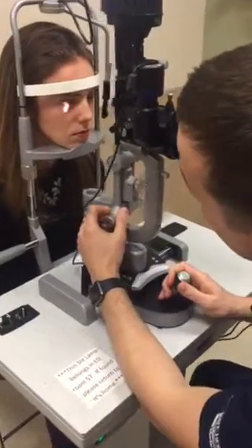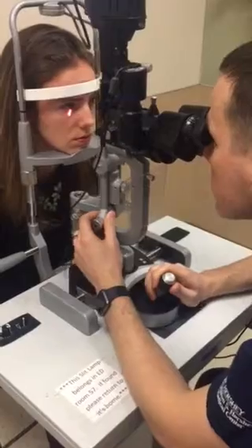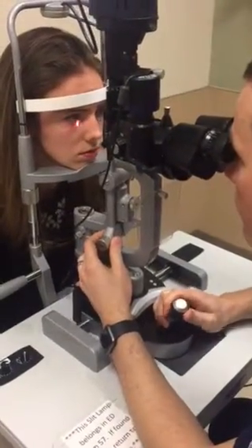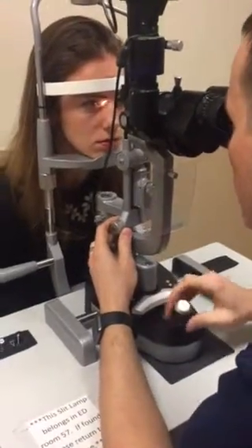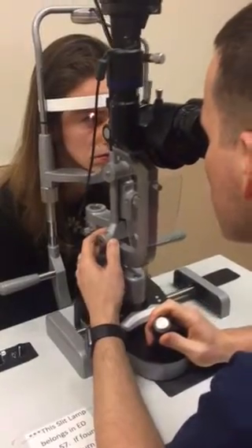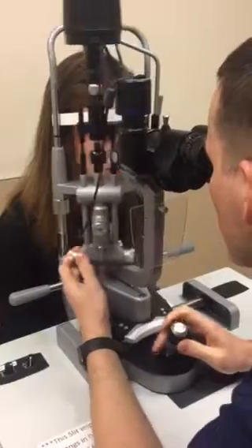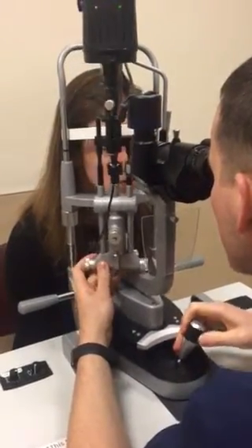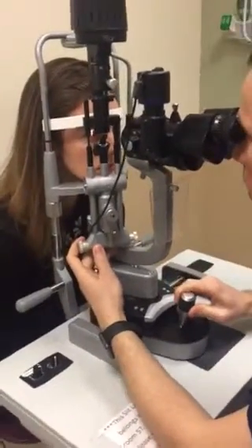For me, I start with the external structures. Looking through the microscope, I'm going to scan the cheek, look at the nose, look at the brow — you can see all of that. Now we're going to do lids and lashes. Looking down here, looking at all the eyelashes and eyelids — of course you can see the puncta. Scan up. Good.